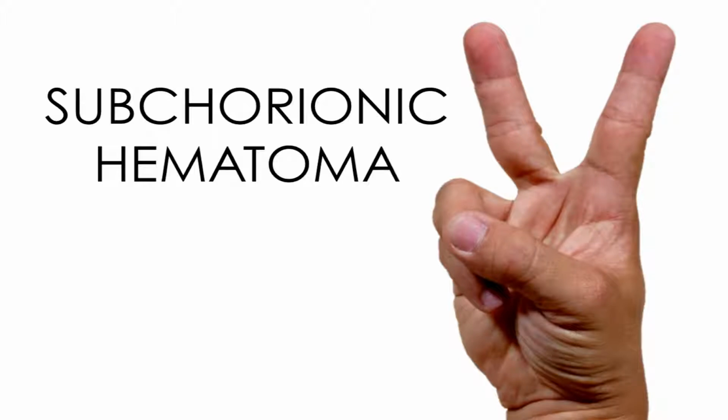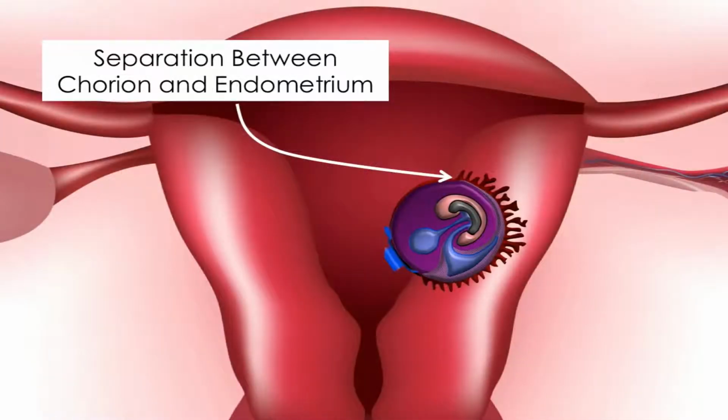A subchorionic hematoma is seen when the chorion and the endometrium separate. Many pregnancies have small subchorionic hematomas that develop normally to full-term births. However, when the hematoma's surface area covers more than 50% of the chorion, it puts the pregnancy at a very high risk for abortion. When this occurs, blood collects between these two structures.